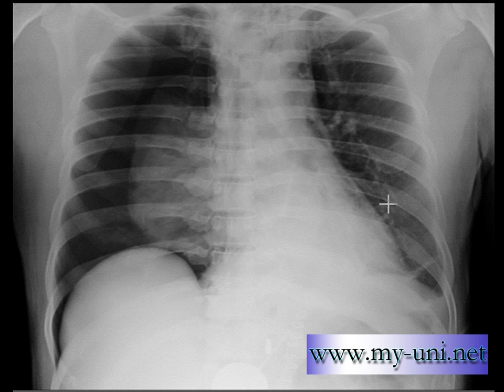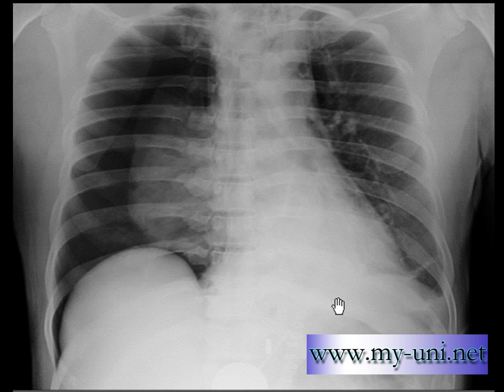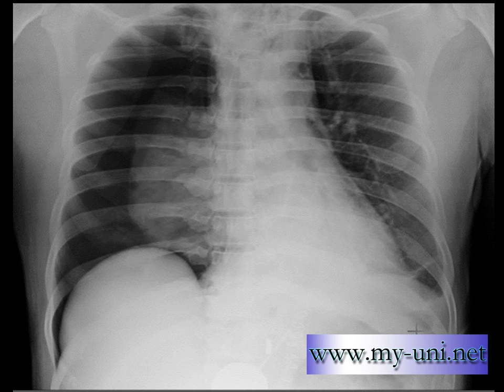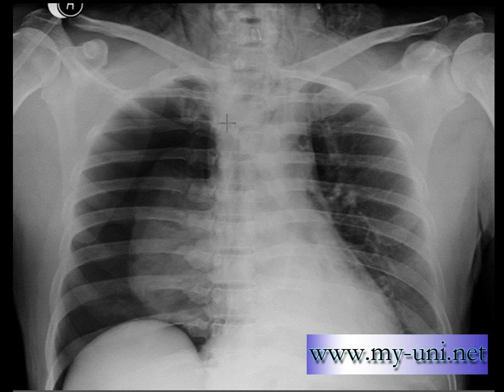You can see the left heart border is clearly visible because on one side of the line you have dense tissue and on the other side you have lung mostly filled with air. This is discoid atelectasis, and the patient probably has a small pleural effusion. Another way to guess whether the X-ray was erect or supine: this is an air bubble in the stomach, which should normally make a straight fluid level in erect position.